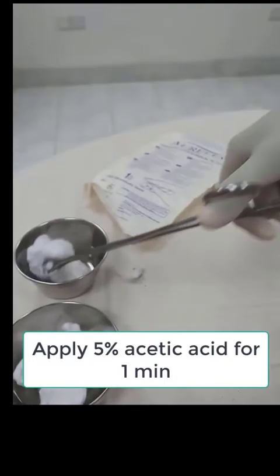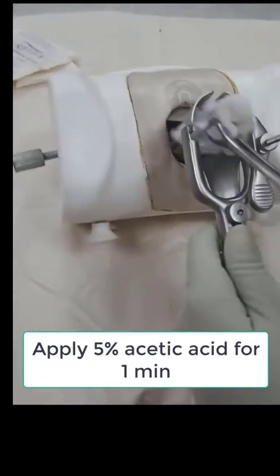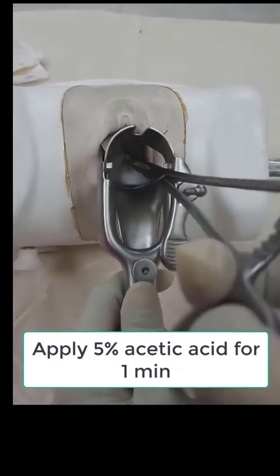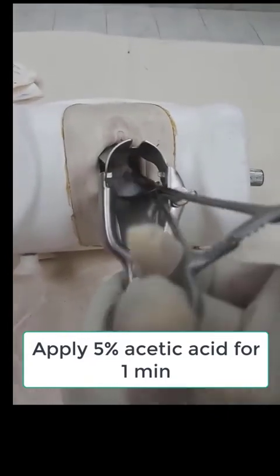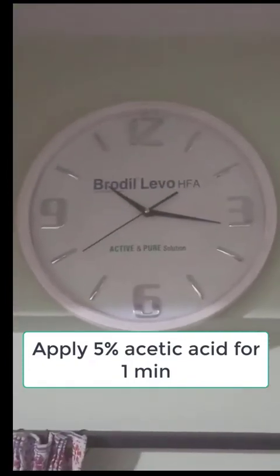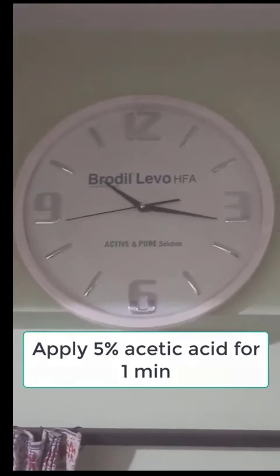Then another cotton swab soaked with 5% acetic acid is placed into the cervix. The whole cervix is bathed with this acetic acid and it is kept for one minute.